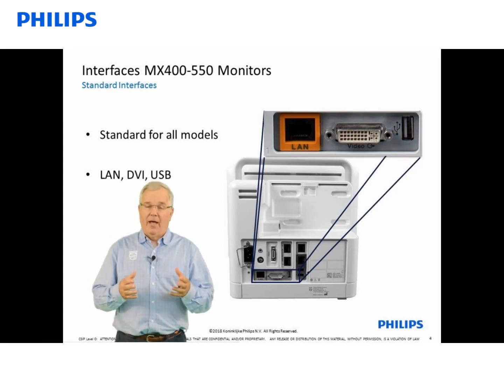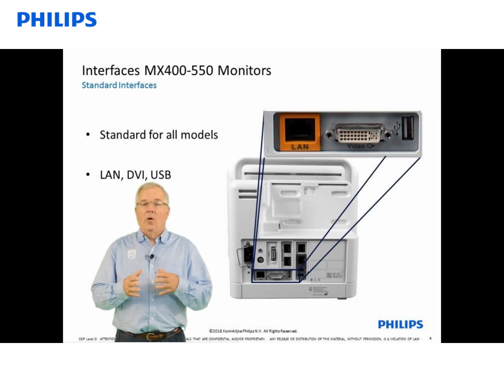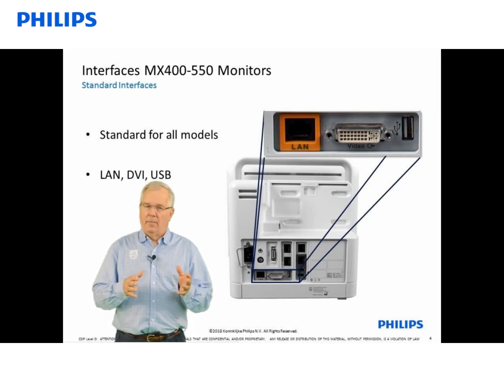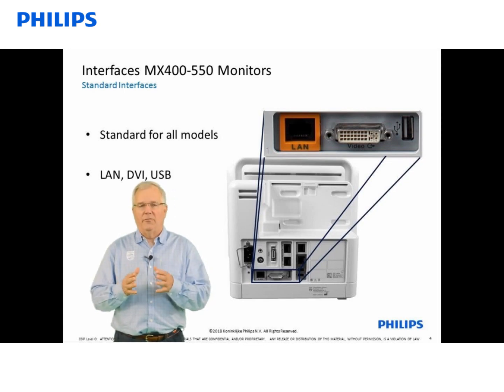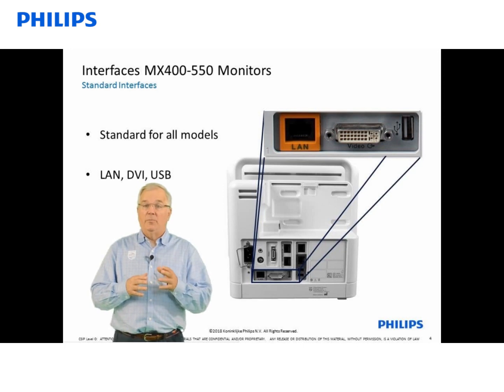Next is a DVI, or digital video interface connector. That connector will allow me to have a slave display with the same screen that's on my host monitor, but just in a different location, like outside the room. We also have a USB port.